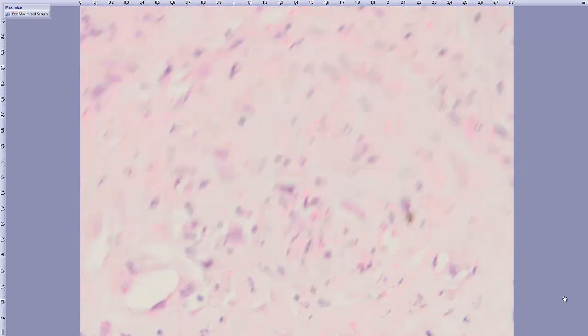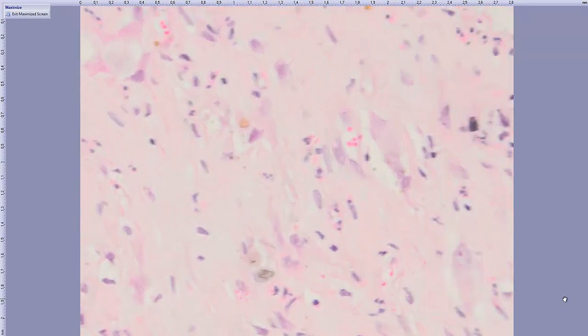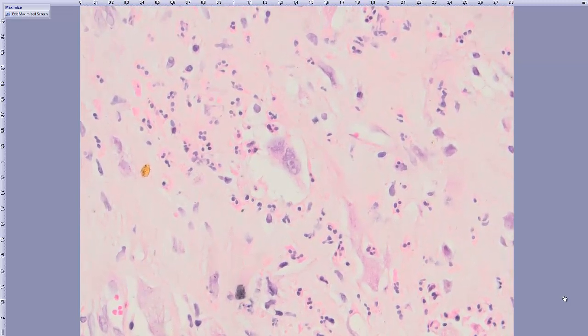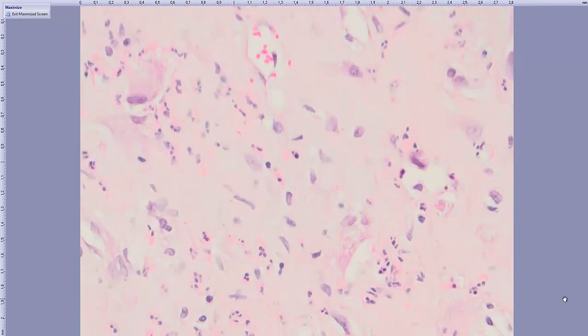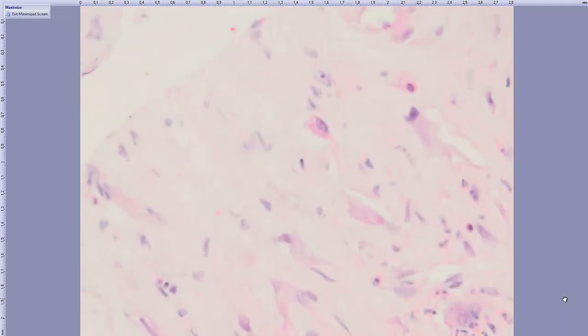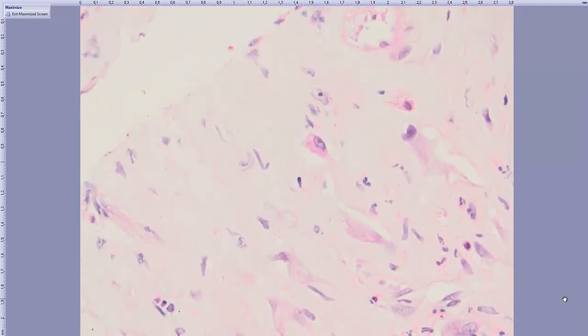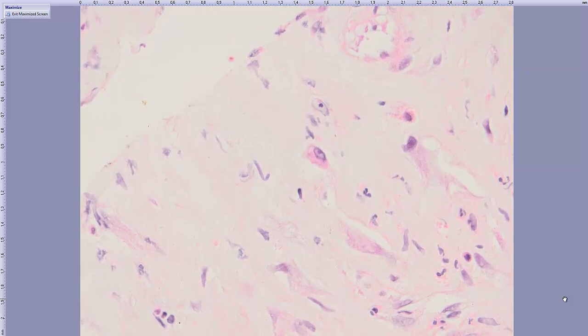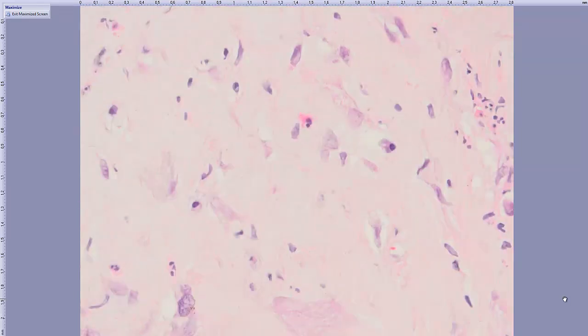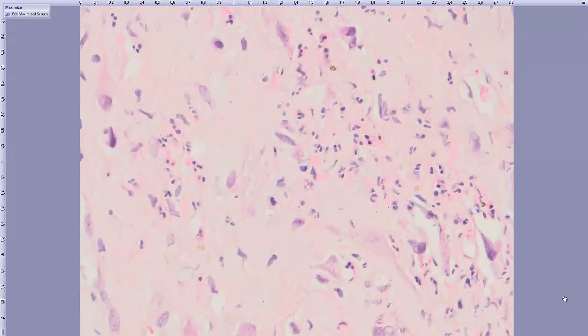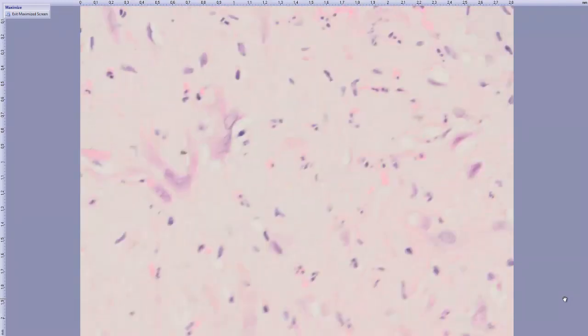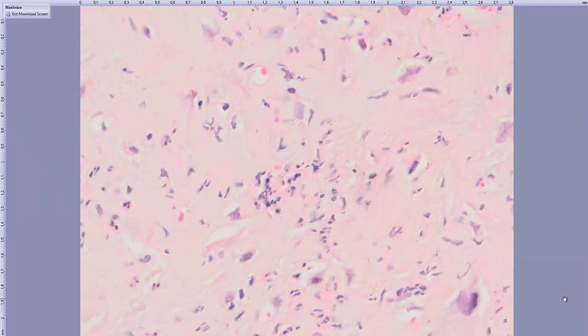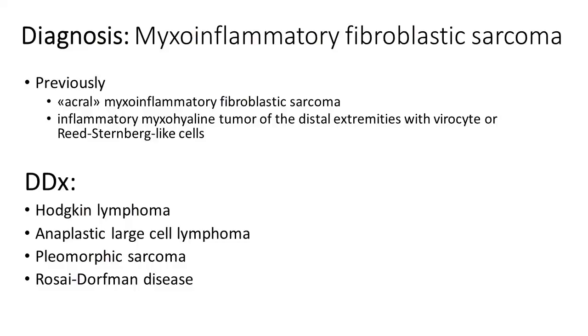Some of them have prominent nucleoli. Here again, this is one of the macronucleoli. We don't have any mitosis. The diagnosis is myxoinflammatory fibroblastic sarcoma. Of course, in this location it's somewhat rare.